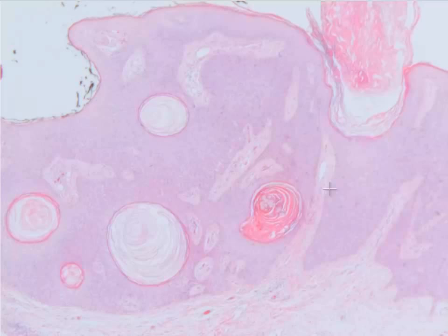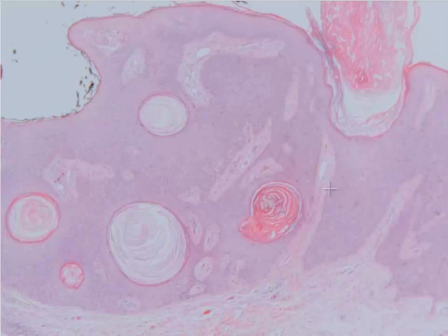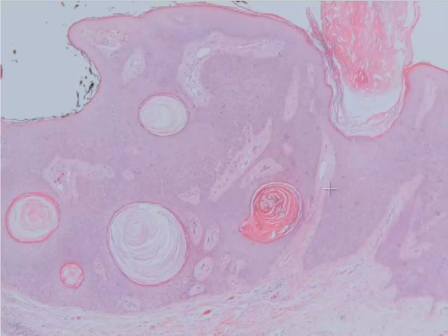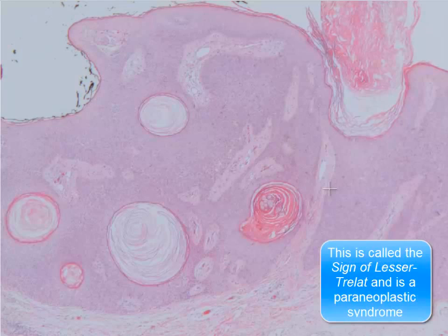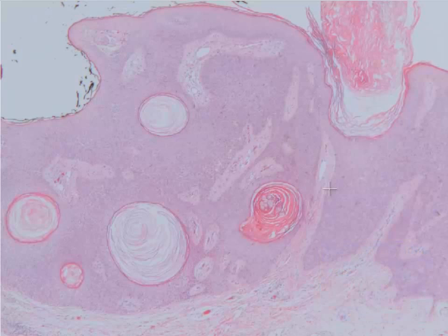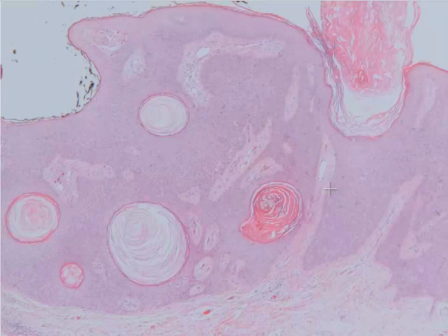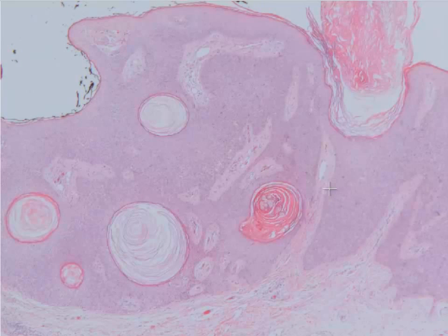These are all features of a seborrheic keratosis that you can see histologically. Remember that whenever you see hundreds of these pop up, one thing you always want to make sure you rule out is some kind of visceral malignancy like stomach cancer. In summary, we have a seborrheic keratosis with multiple keratin cysts and a basal proliferation of cells.